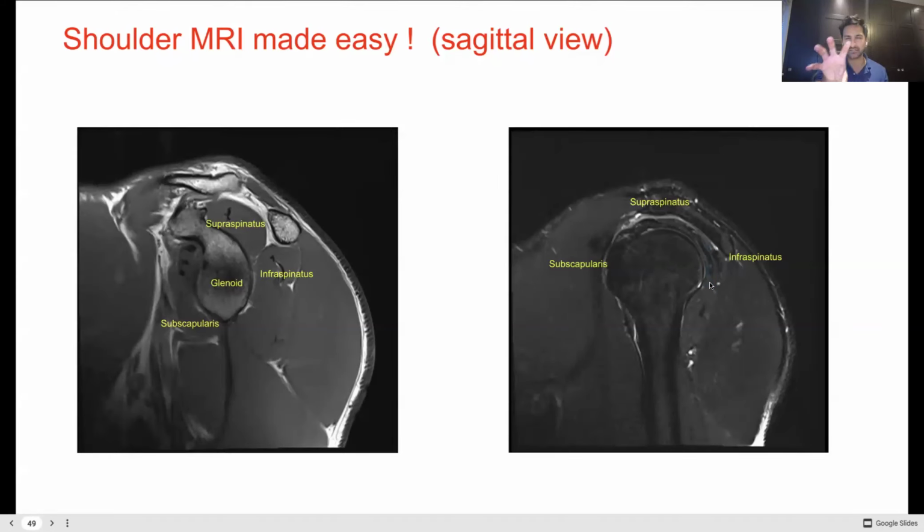So you just have to look for that haircut and think, okay, how much of the hair is gone, which part of the hair is gone, and then infer that that must mean a certain tendon is torn. But also what can happen is that someone's got the clippers and has gone right down like that. And so then you'd have a partial, not a full width, like a middle third full thickness tendon tear. Or sometimes you even just get a perforation. Someone's literally got a very thin clipper and just gone down.